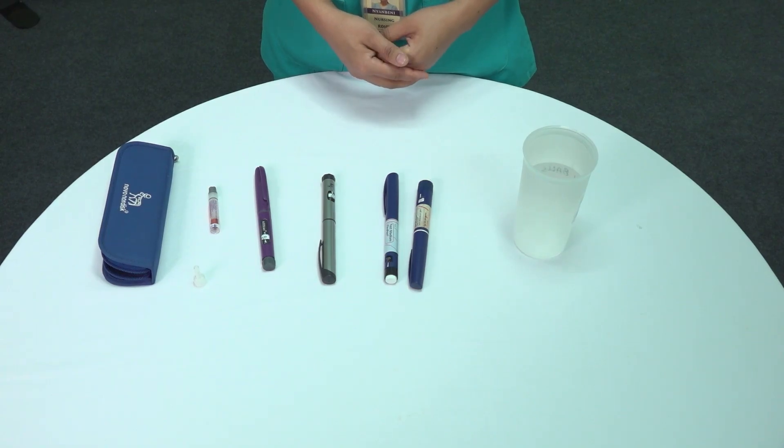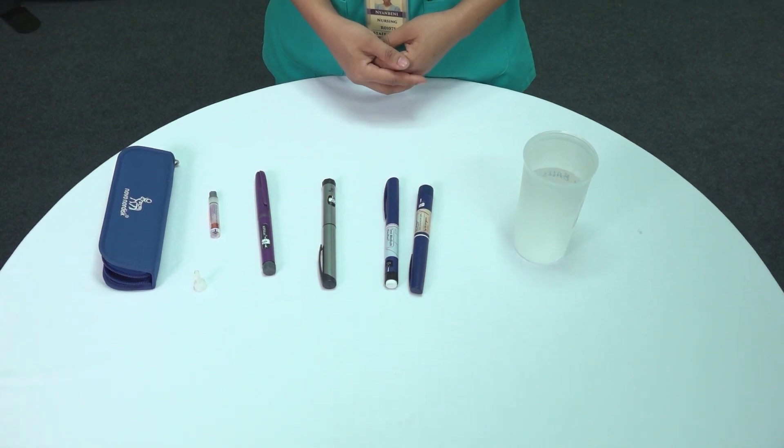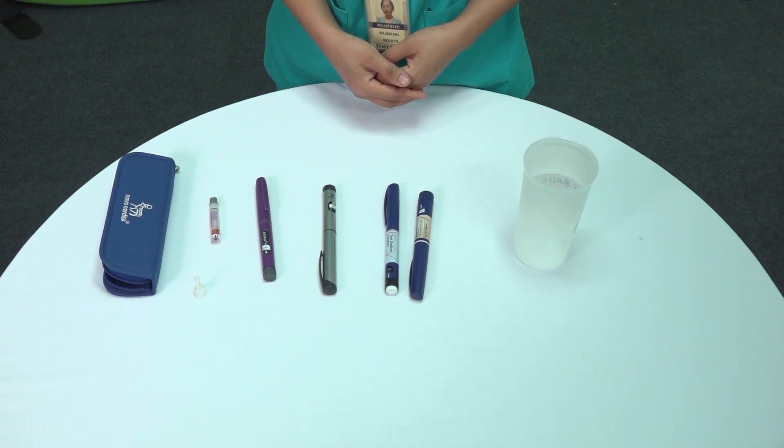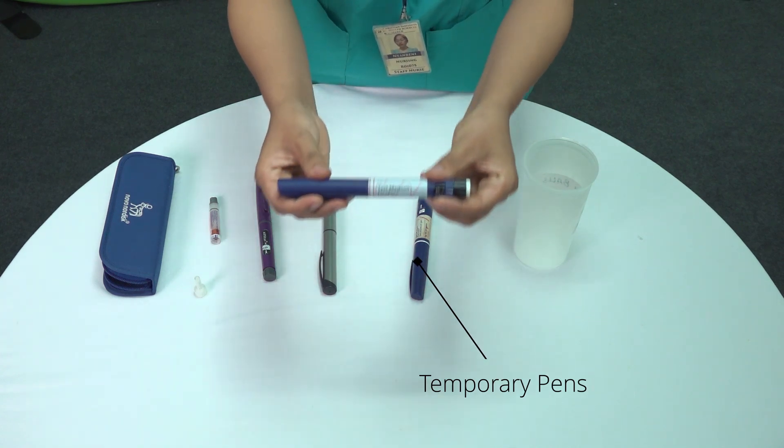We're going to break down the different types of insulin pens that are commonly used in diabetes management. Insulin pens come in two main categories: temporary pens and permanent pens.